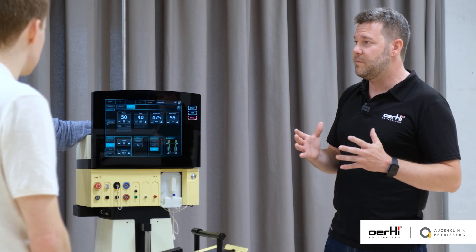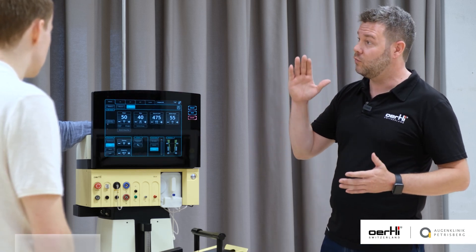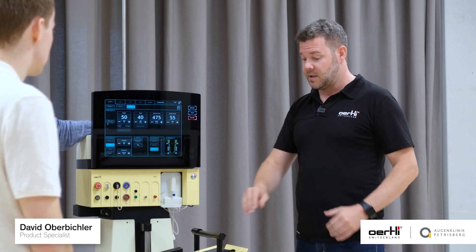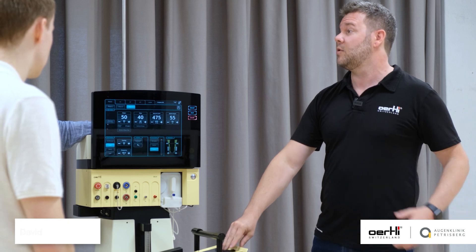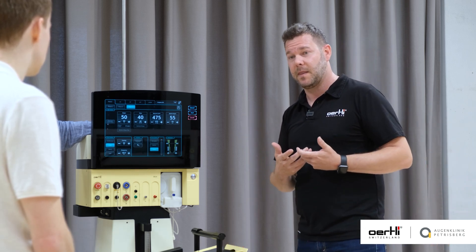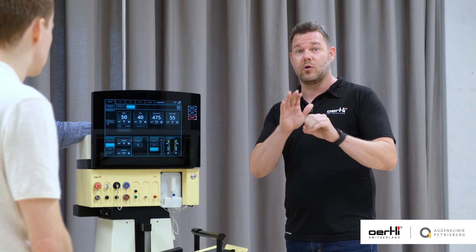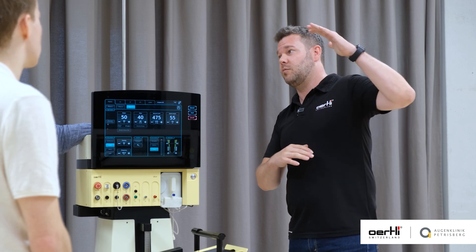On the Venturi pump you directly control the vacuum with your foot pedal, and the vacuum is instant — as soon as you push down you create a vacuum and aspiration. On the peristaltic pump, on the other hand, you need to have occlusion on your instrument in order to make the vacuum rise.